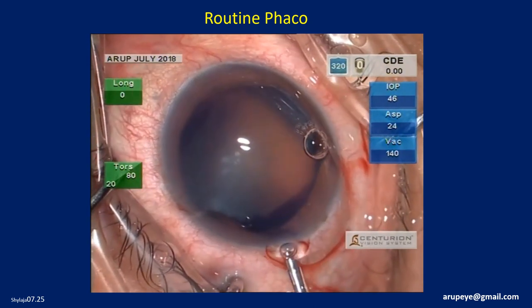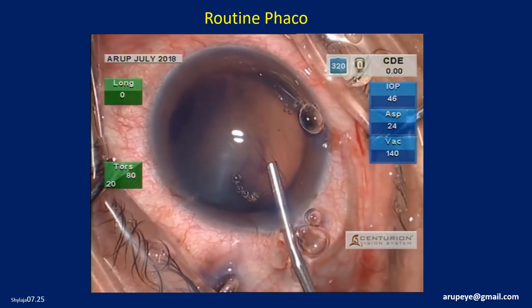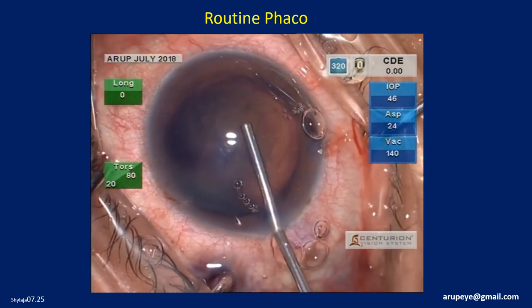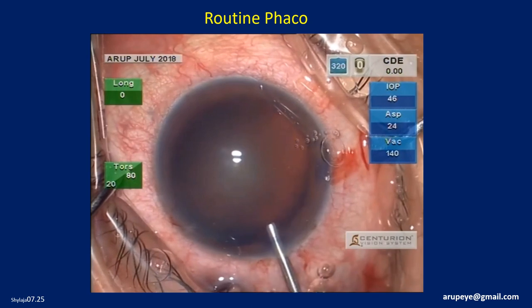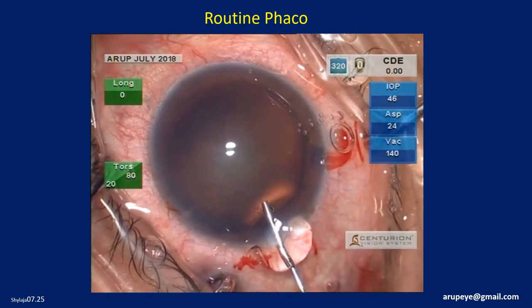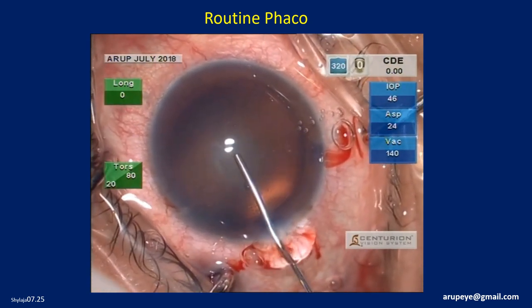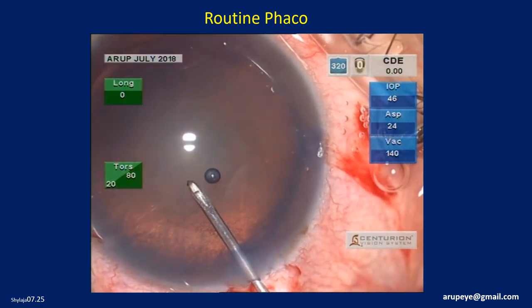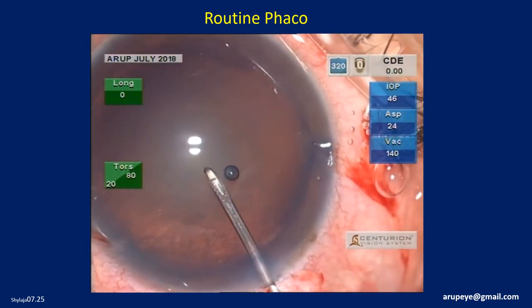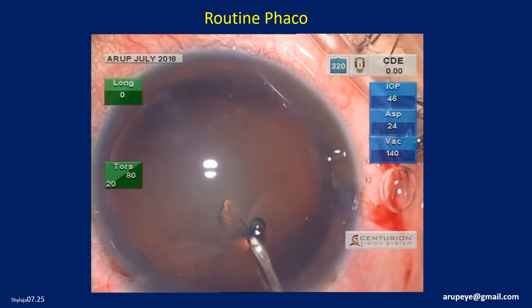A modified soft shell technique will be employed. First, 2% HPMC is injected into the anterior chamber. Then, underneath, Helon GV 1.4%, which is a cohesive OVD, is injected in front of the anterior capsule.